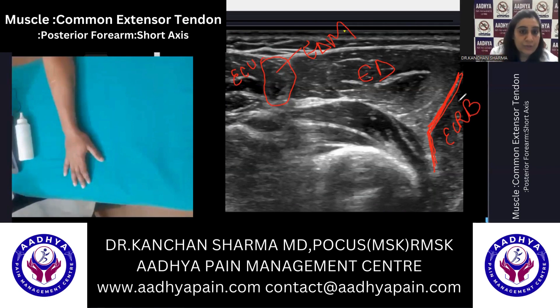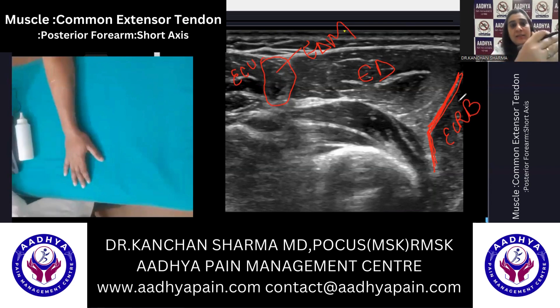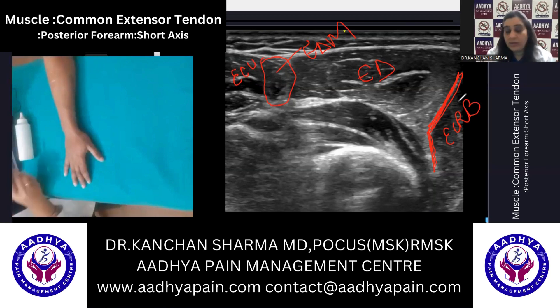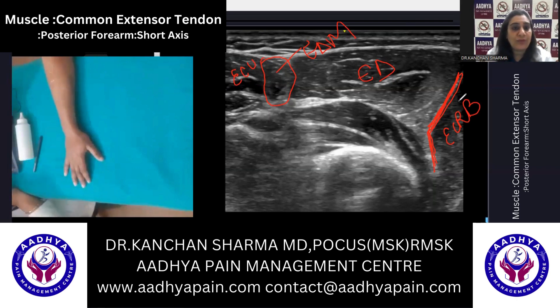From there you can follow them where they take their origin from the common extensor tendon, or you can follow them down to the dorsal compartments and look at their insertion. This is an easy way to find out the different muscles forming the common extensor tendon.